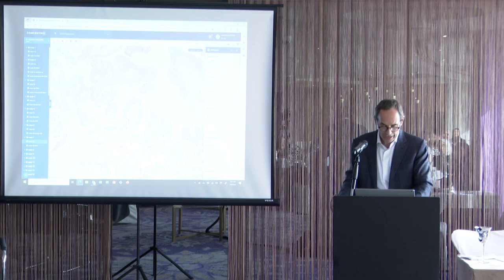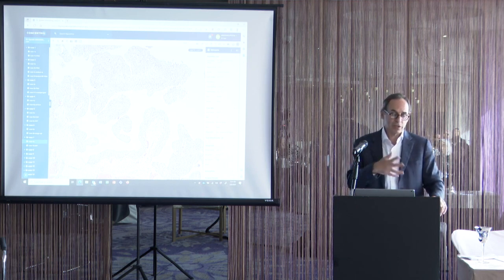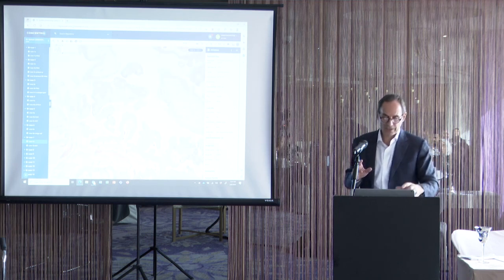So in terms of grading bladder cancers, there are multiple factors that go into deciding whether something is low grade or high grade. First is architecture. In low grade, the papillary fronds tend to be fairly distinct, not fused. So if I were to look at this biopsy, that would favor low grade.